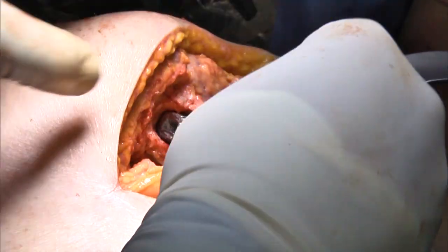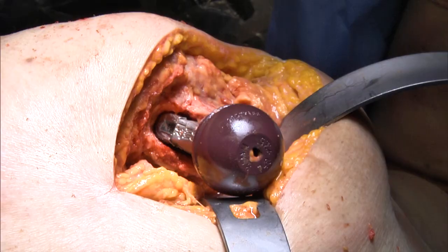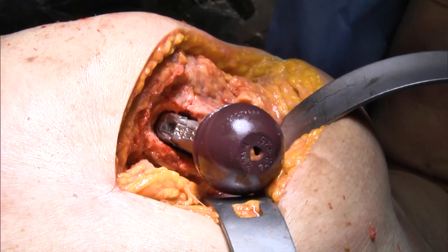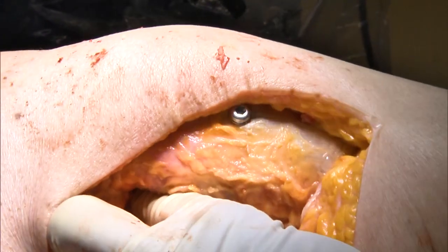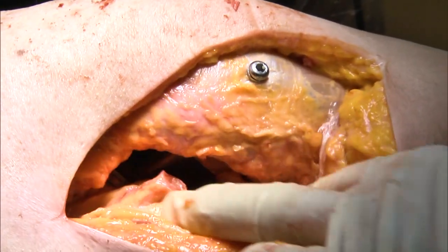I've completed broaching and now we're going to trial. I'm going to reduce the hip. Let's take out the retractors. Okay, and we're going to bring the hip down and in. There we go. I like the feel of the soft tissue tension.